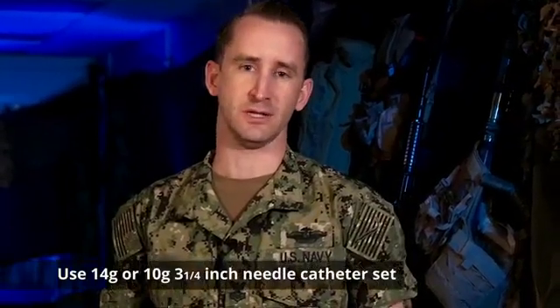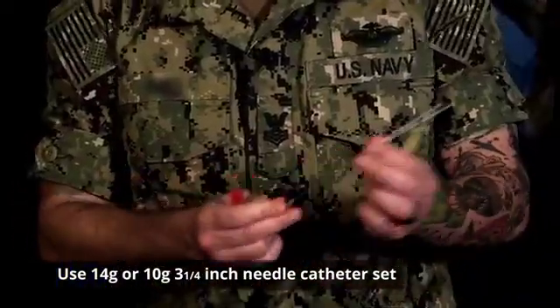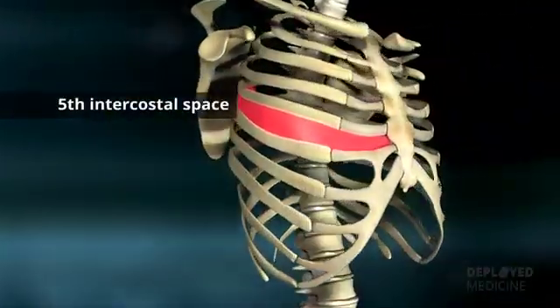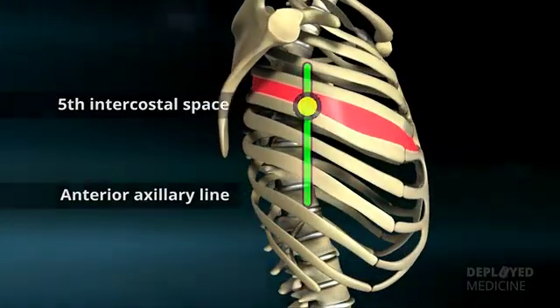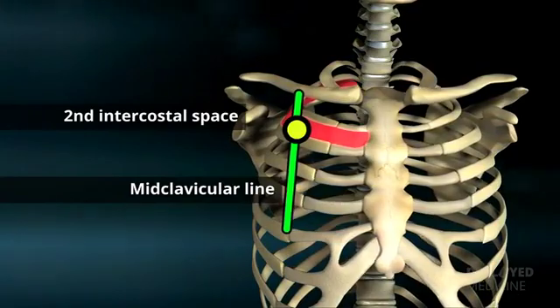The needle chest decompression is performed using a 14 or 10 gauge, three and a quarter inch needle catheter. There are two acceptable sites: the fifth intercostal space on the anterior axillary line, or the second intercostal space at the mid-clavicular line.